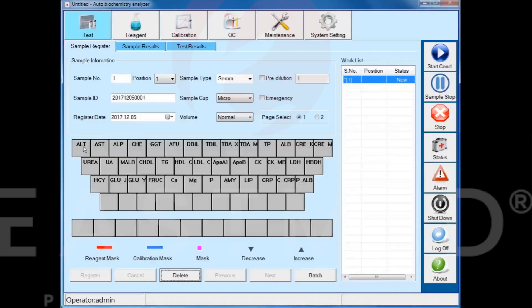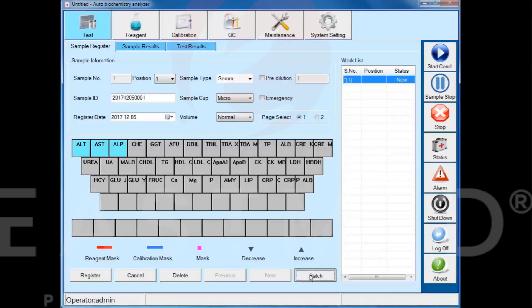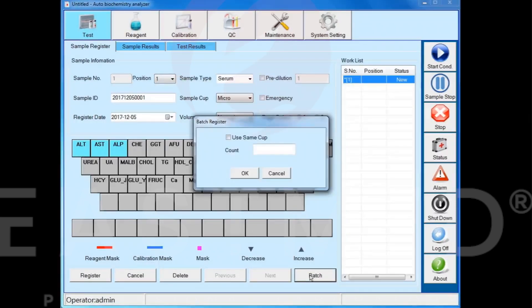Select the items to be tested and click the batch button. Enter the number of test samples, then click OK to complete the batch registration.